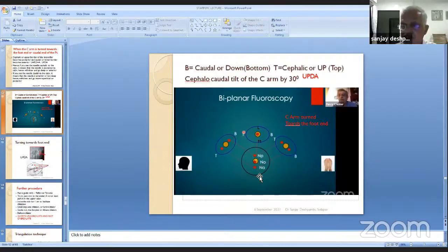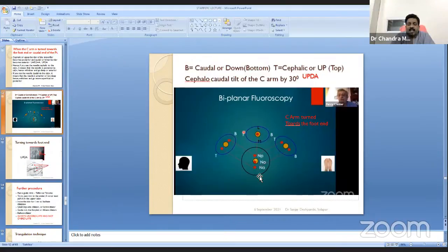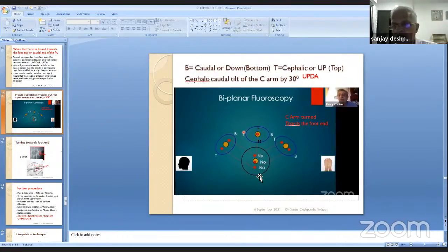Thank you very much. Sir, what ureteric catheter do you use? Do you use one with multiple holes or a single ureteric catheter? No, with a single hole catheter. Normally I'm using five or six French.